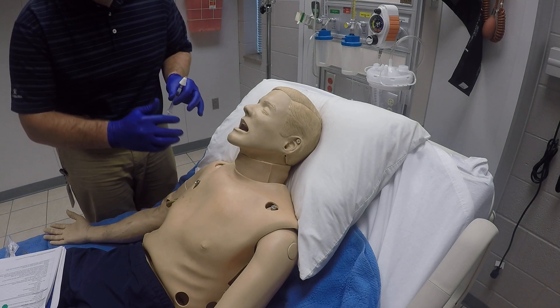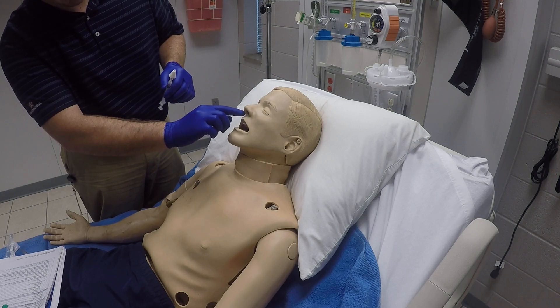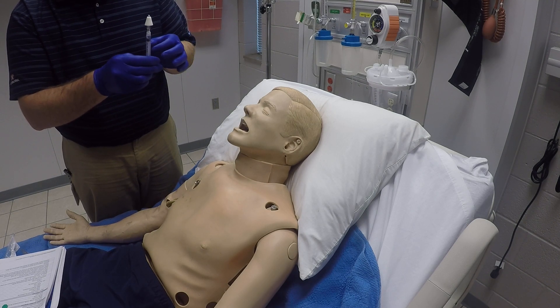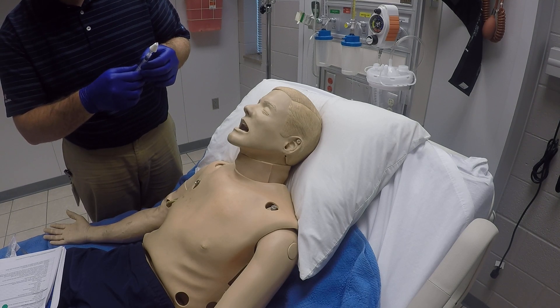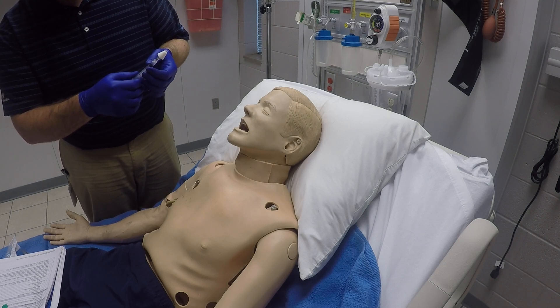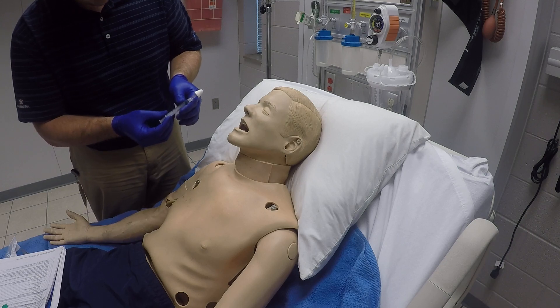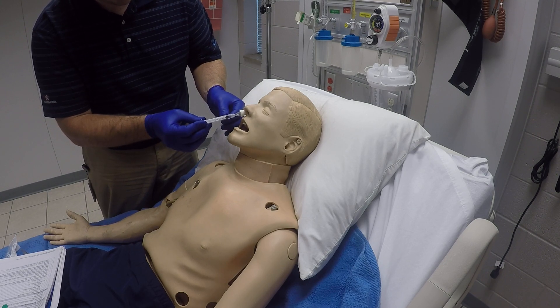We'll go ahead and check our patient to see which nostril is larger and make sure there are no obstructions. We'll choose based on that which nostril we actually want to use. Double check that we have all of our medication in there, no air bubbles, and the right dose.